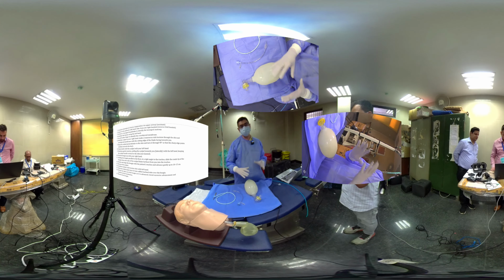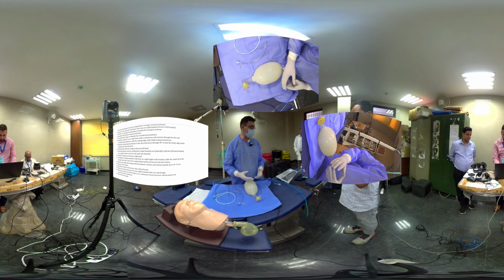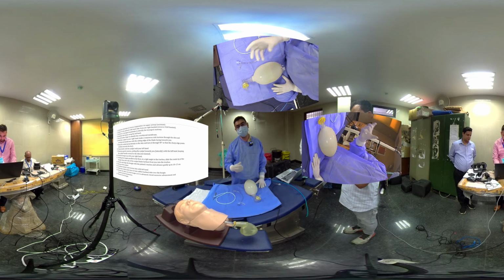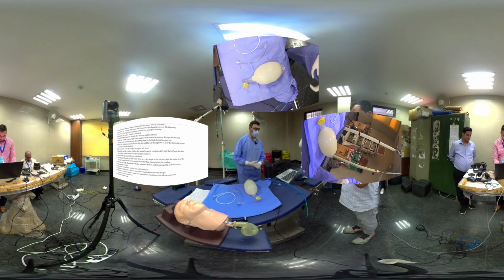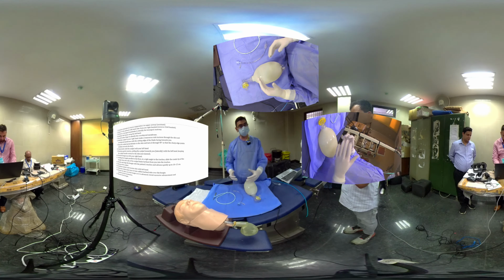I will tell you the steps in brief beforehand so that we know them when we are doing the steps. Whenever the situation arises, we have to continue the steps of oxygenation, though the oxygenation has failed because of intubation, supraglottic device and mask ventilation, but still oxygen has to be applied and steps have to be continued. If you are a right-handed person, you have to stand on the left side of the patient so that you are able to do the steps properly.